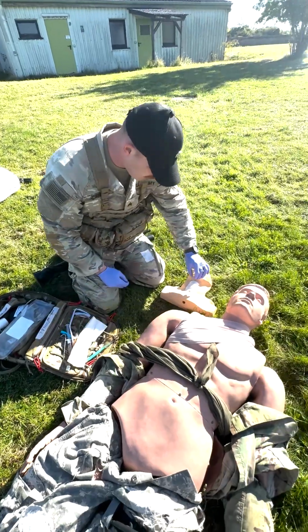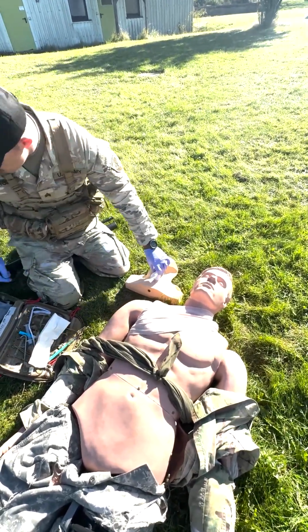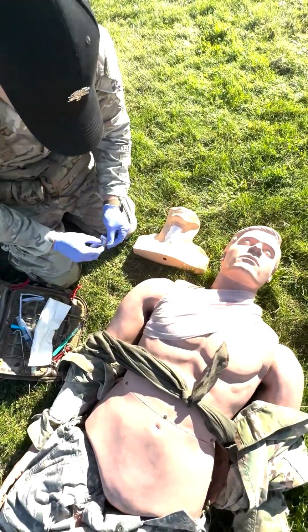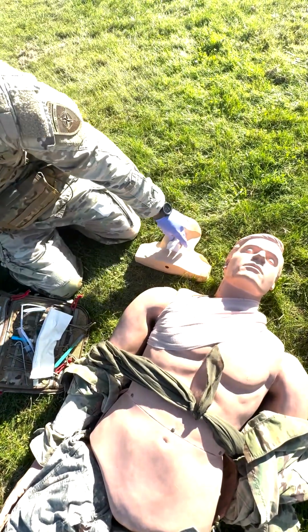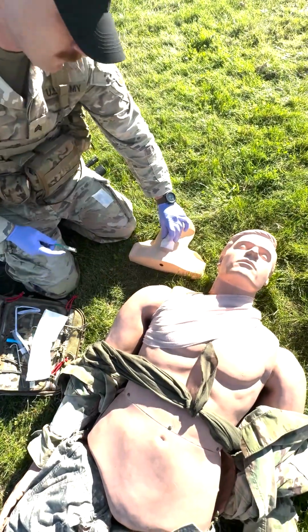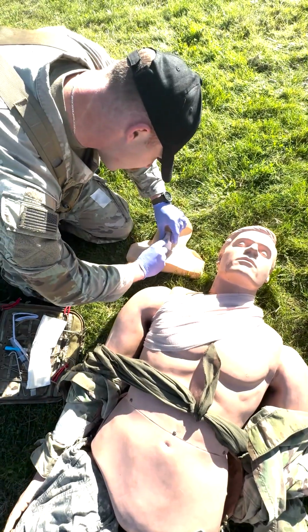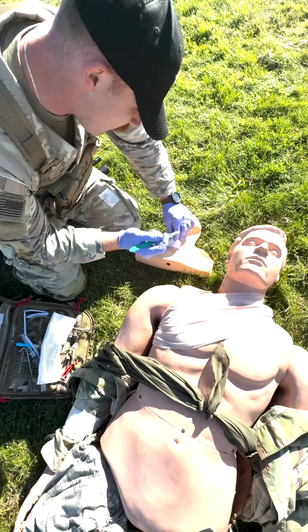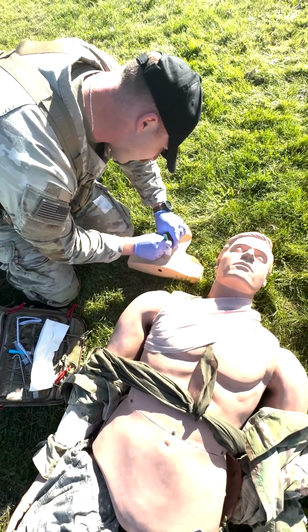Okay, I'm going to identify the cricothyroid membrane. My hill, valley, hill. I'm going to go ahead, cleanse my site with an alcohol prep. Site is clean. I'm going to go ahead and stabilize the larynx with my non-dominant hand. Reconfirm my index finger. Take my scalpel. I'm going to make a 1-inch vertical incision. Reconfirm my landmark with my index finger. Turn my scalpel horizontally. Poke through the membrane with a 1/2-inch incision.